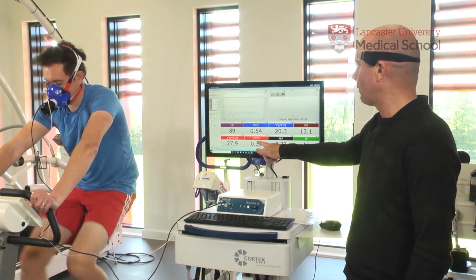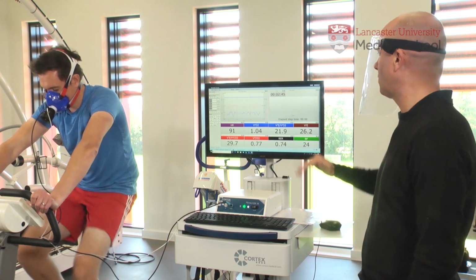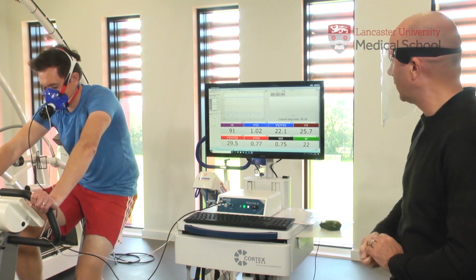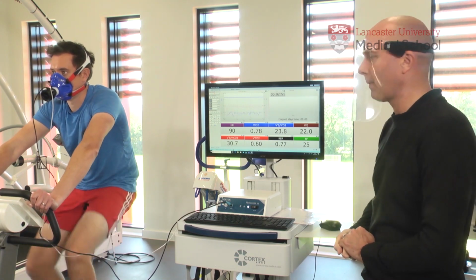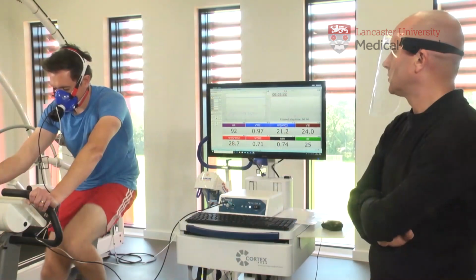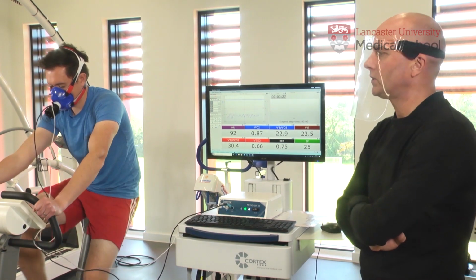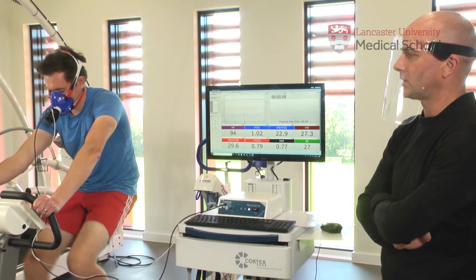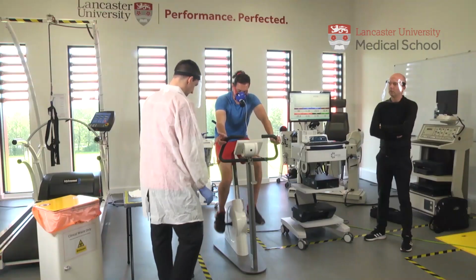We also have the volume of carbon dioxide breathed out, his respiratory exchange ratio, and his breathing frequency. And here you can see in litres how much air he's ventilating per minute. So now in the last 30 seconds of the first 4-minute stage, Jack is going to take a fingertip sample of Chris's blood.